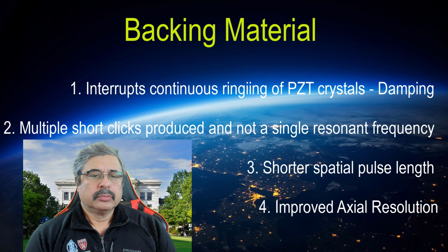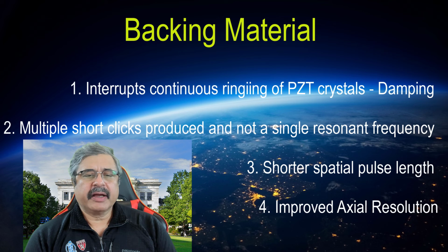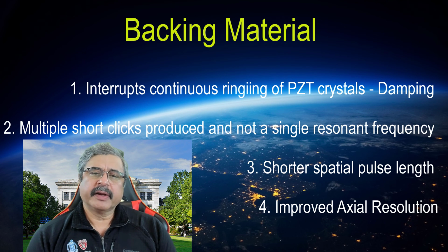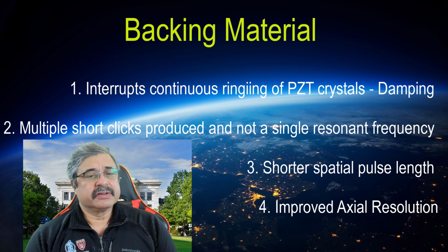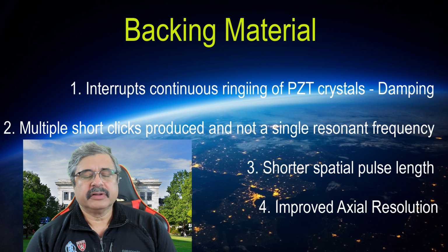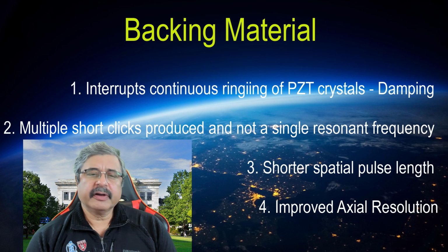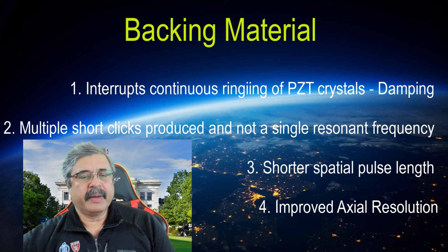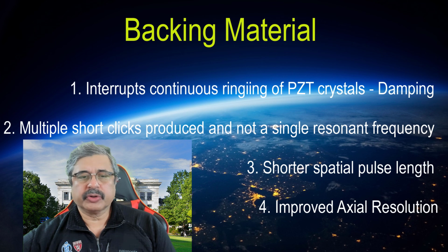Therefore, bottom line regarding the backing material is that it is applied in and around the piezoelectric crystals to prevent them from continuously ringing as a result of stimulation. That interruption of ringing by the backing material results in production of multiple short clicks as opposed to one long resonant frequency. These short clicks have a range of frequencies in them and lead to shorter spatial pulse length, which eventually leads to an improved axial resolution. So that's the function of the backing material, that it causes damping to shorten the spatial pulse length.